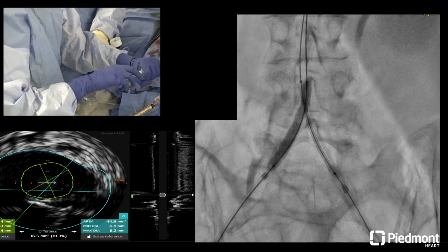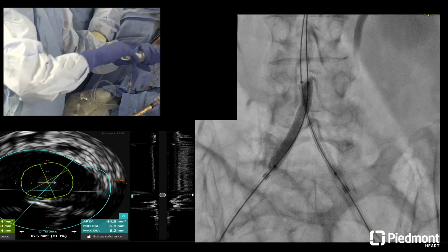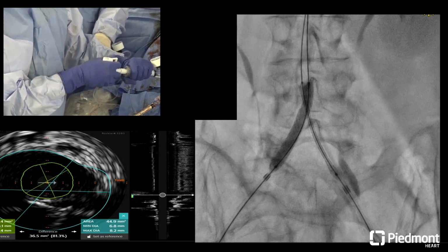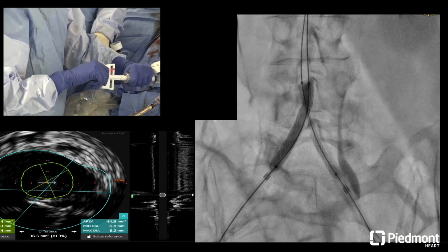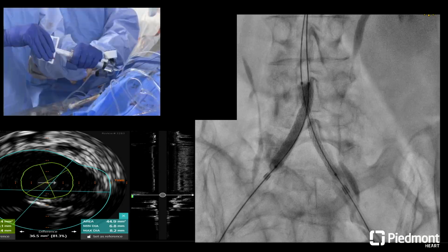Let's go to 8. 7's probably the smallest I put in there, even in small women. I think the 6 would be undersized. No, you can push it higher later, but I agree with starting with 7s. And normally, I think in a normal male, I'd be going 8 to 9, but let's start off a little bit on the slow side.